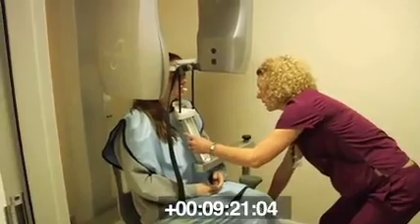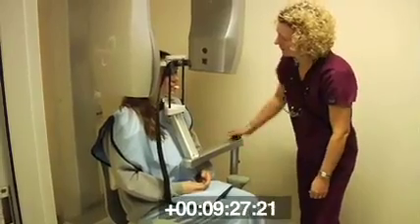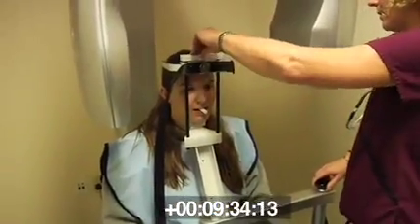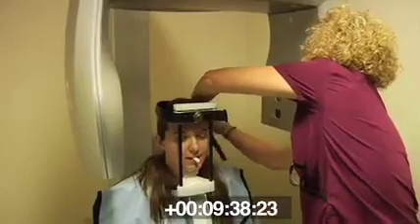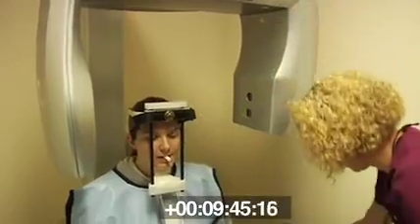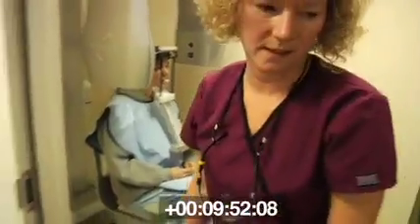Just sit real tall, scoot your back all the way against the chair. Bring this up to your chin. Okay, rest your chin there for me and your forehead forward. Okay? Put up your ponytail here. Lock in. Okay. Now sit real still for me. I've got a couple settings to set here.